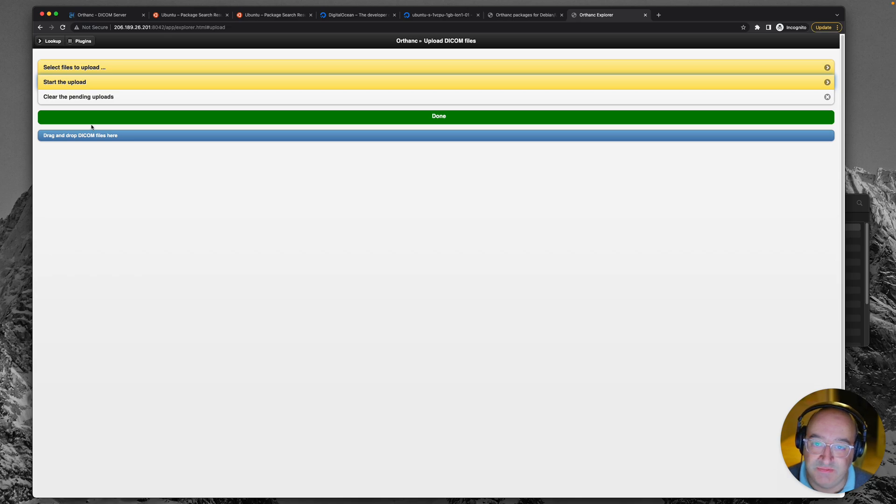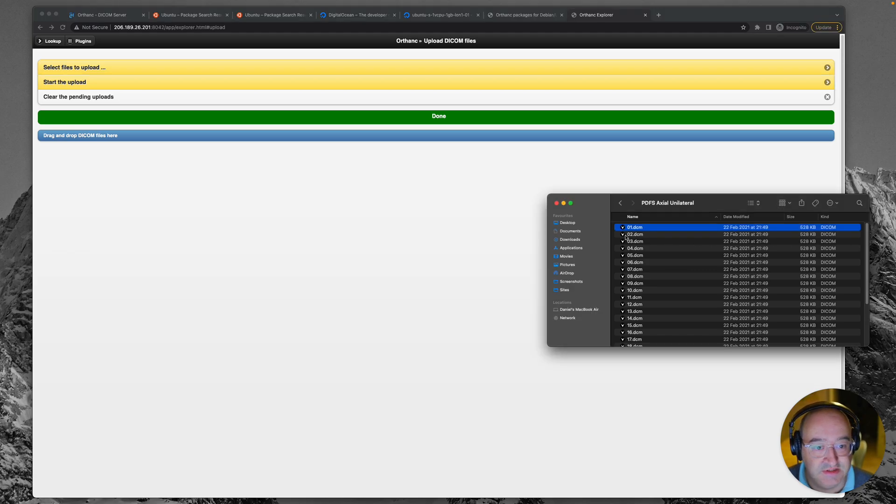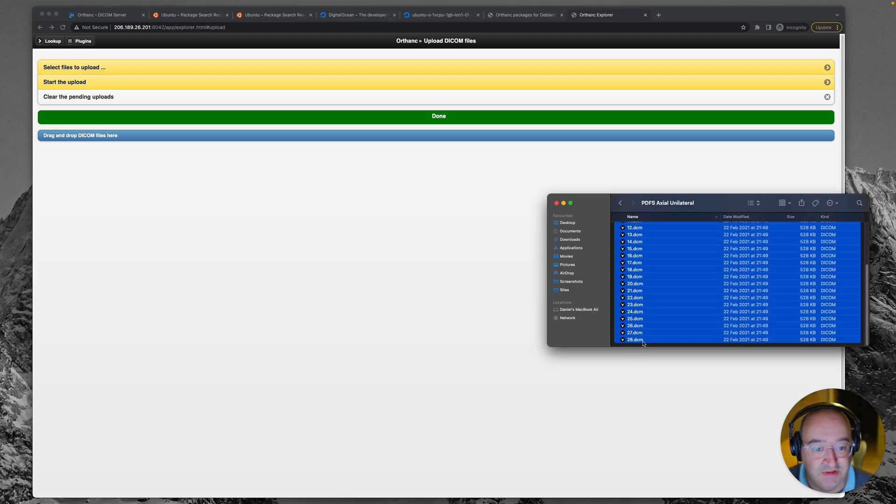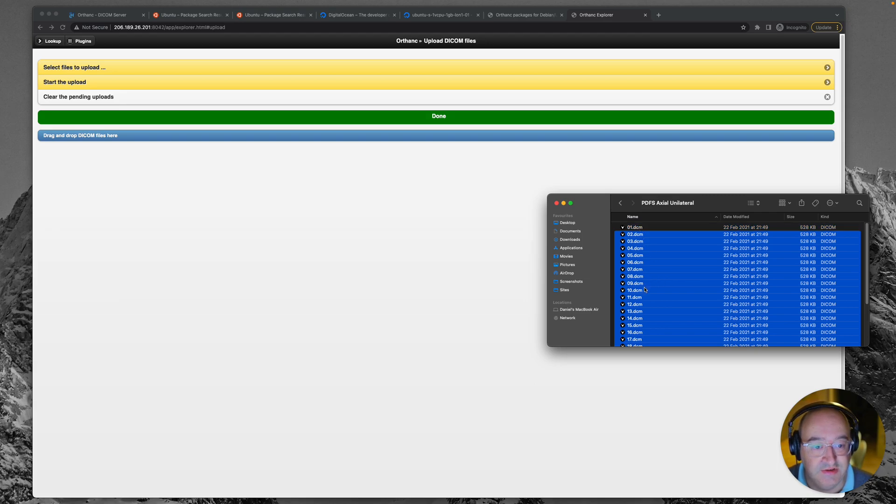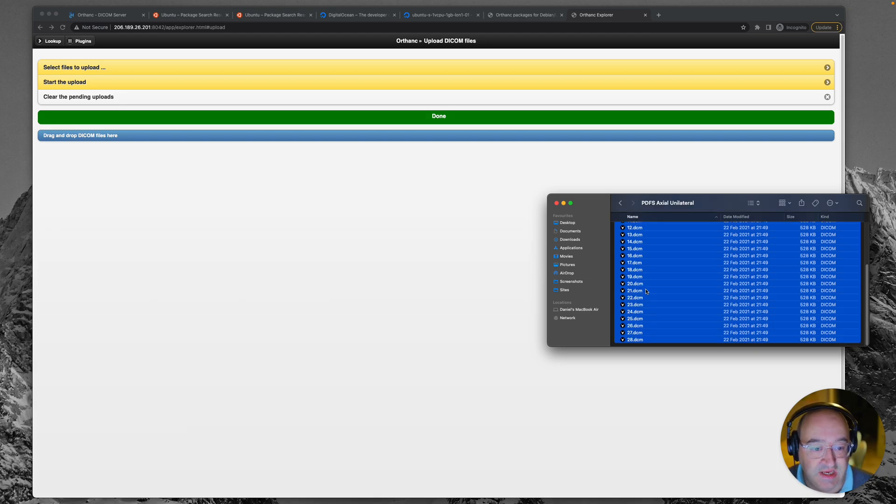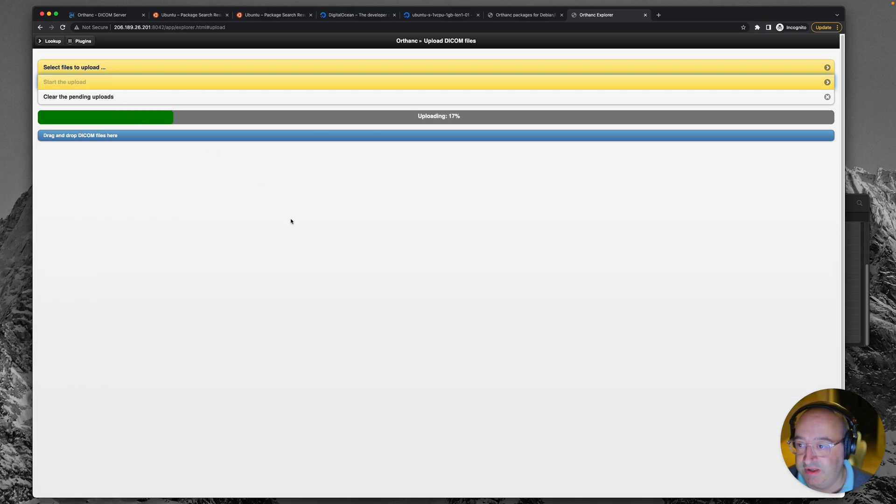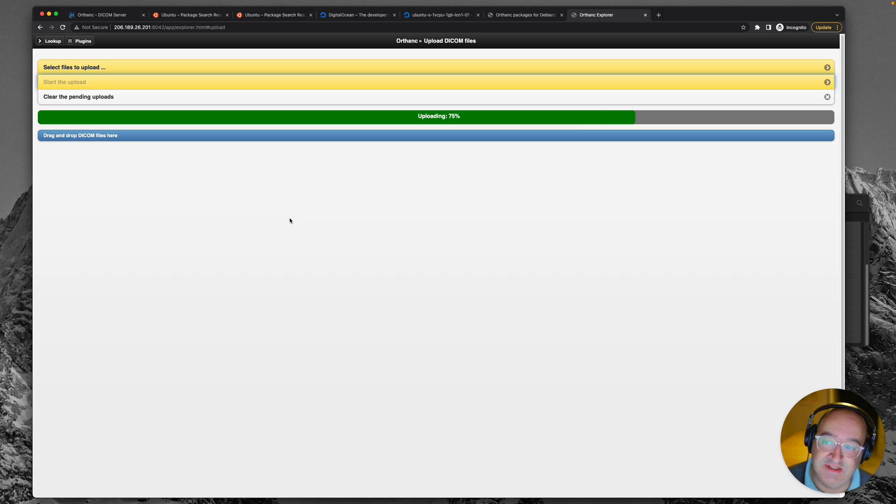Okay. So maybe it doesn't support the dragging of whole folders across. Let's just try to see if we can actually have multiple images. We've already got that one. So I'm in the folder and I'm dragging multiple images. Start the upload. Yes, that does seem to work. It's a shame it doesn't allow you to just drag a folder on that would be much easier, wouldn't it?